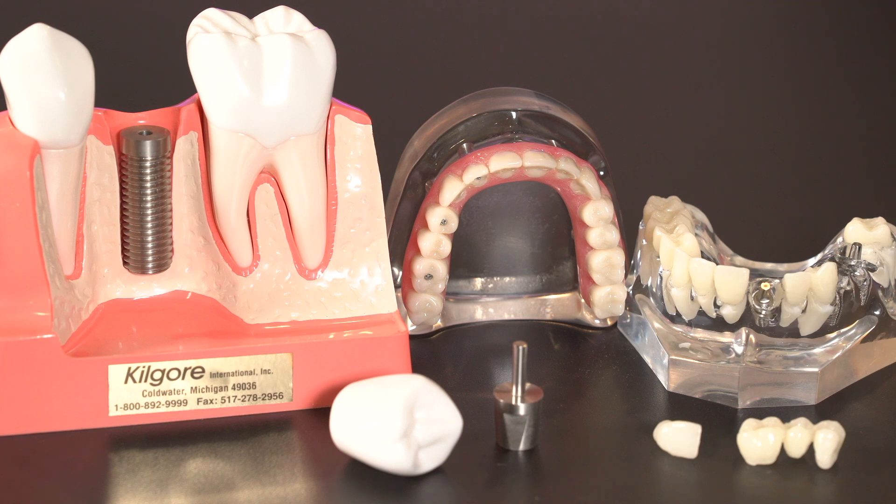If you're confused about all the parts that go into a dental implant and its restoration, you're certainly not alone. That's because a dental implant and its supported restoration is a very complex dental procedure that involves several steps and a number of parts all working together to replace the missing tooth. In this video, I'm going to give you a simple rundown of all the parts that go into a dental implant and its restoration — what they are, how they work, and in what order they should be used.